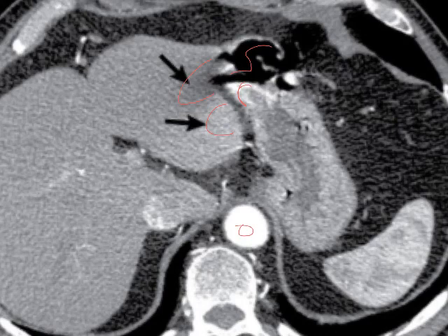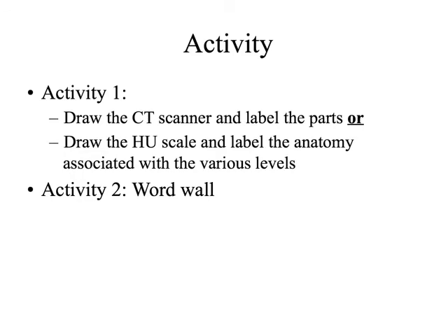That's a gradient. A gradient is just a shift from one level of red to another level of red. In this case, it's a shift from one level of white to another level of white, or a shift from one level of black to another level of black. So we can see that shift here. It started out black and got less black, started out white and got less white. That's the fancy word, that's a gradient. You can barely see that. It's very hard to see, but we call that an edge gradient. So here are some activities for us.